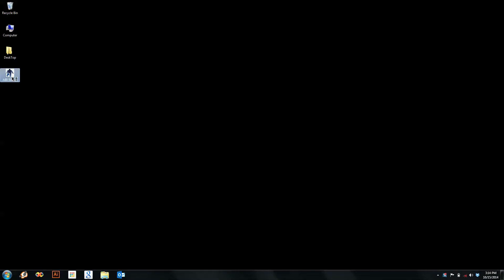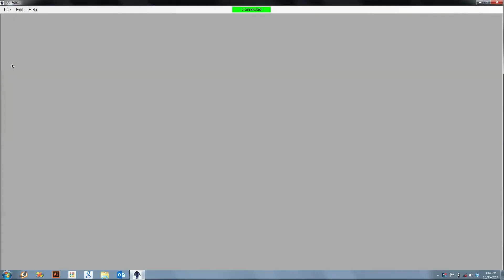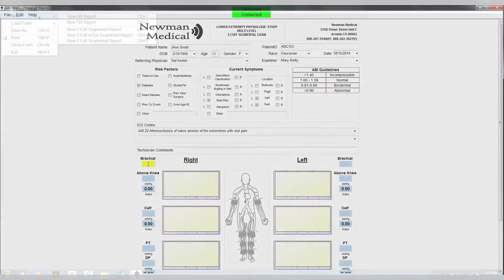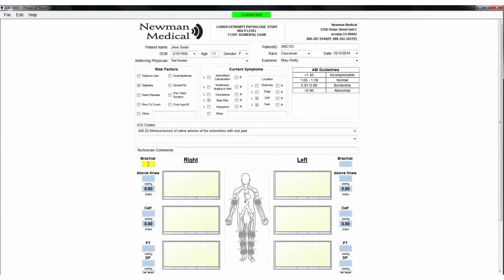On the computer desktop screen, select the Simple ABI Reports icon. When the screen opens, click on the File tab, then New, and then select the 3-Cuff Segmental Report. Fill out the patient information, risk factors, current symptoms, ICD codes, etc.